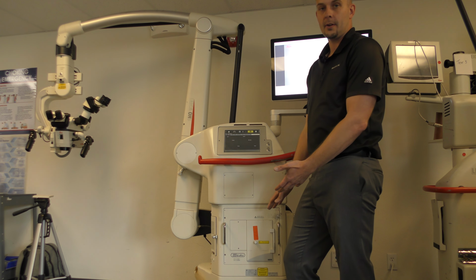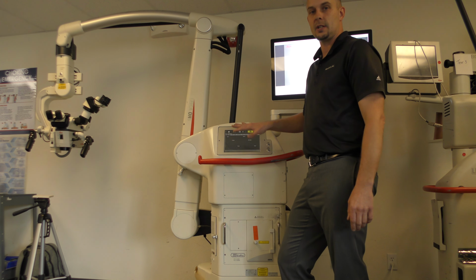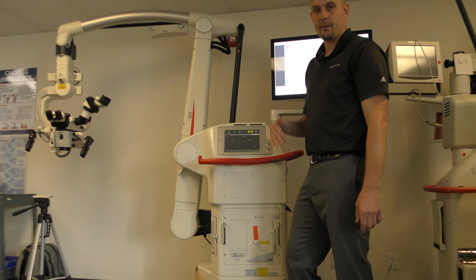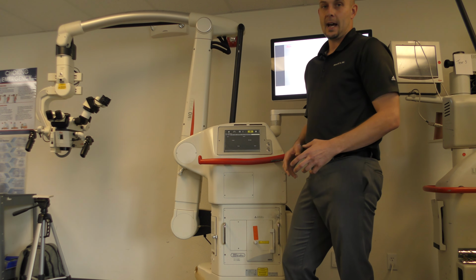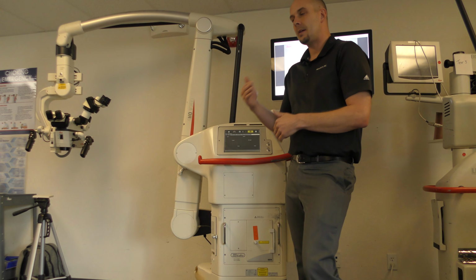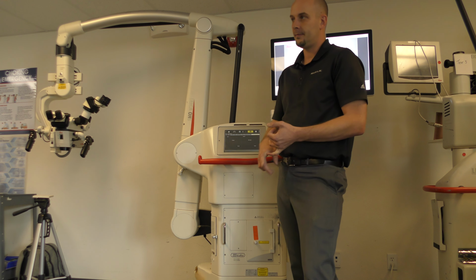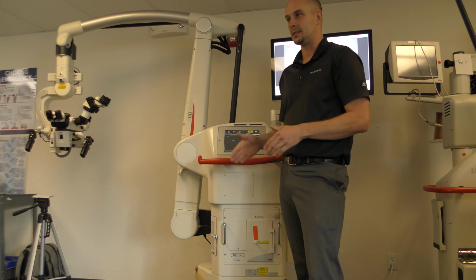This bulb is rated for 500. You can run them well beyond that. It's extremely important that when you get that error message you call me, and my number will be right here on your microscope, or you call Biomed and have it replaced. I will also go to Biomed and be very clear about that. Typically at that stage, you sometimes will get some pushback from Biomed. Some Biomeds think that they're rated for like 750. You might hear a variety of different things.